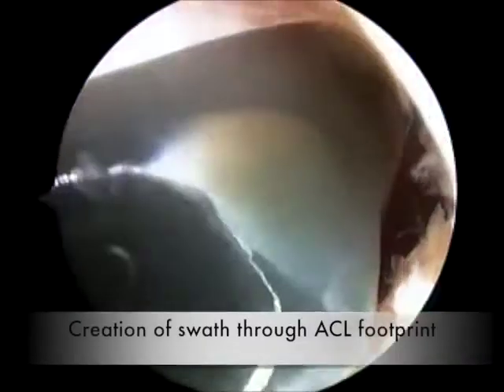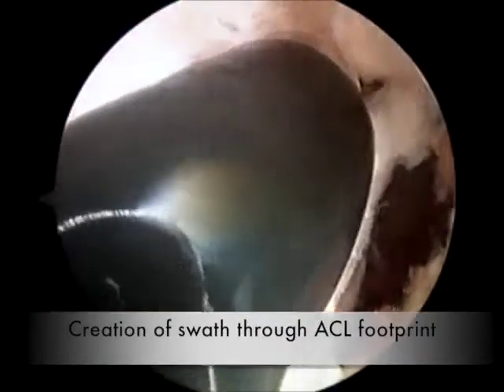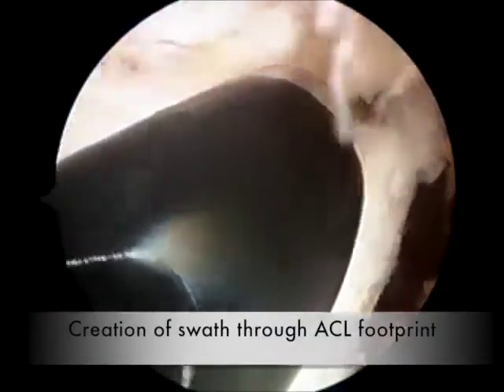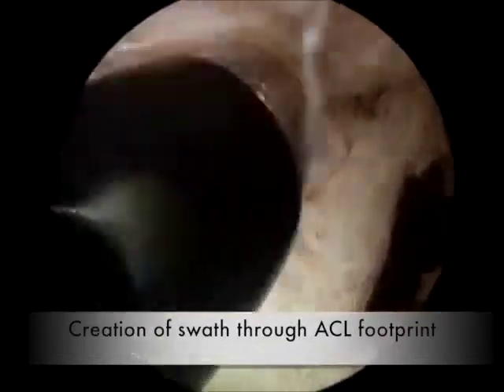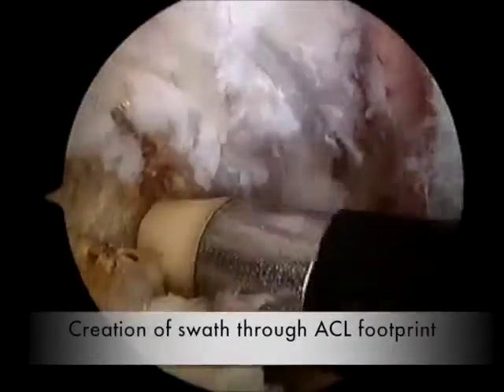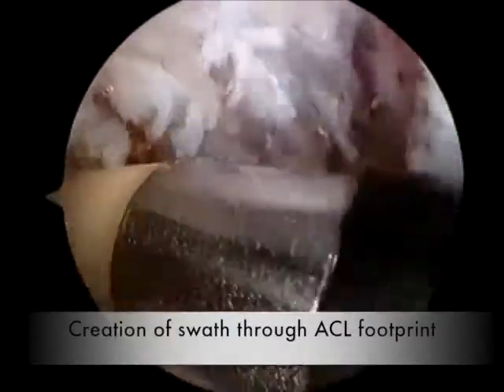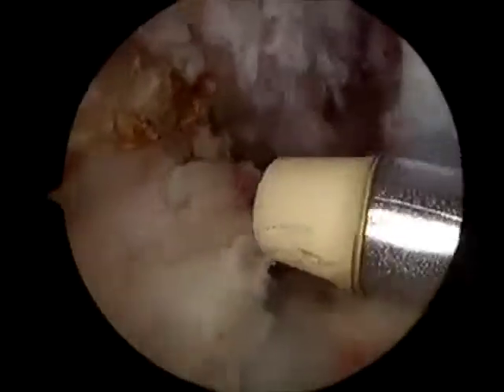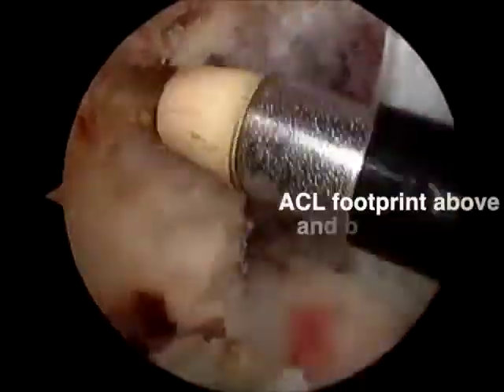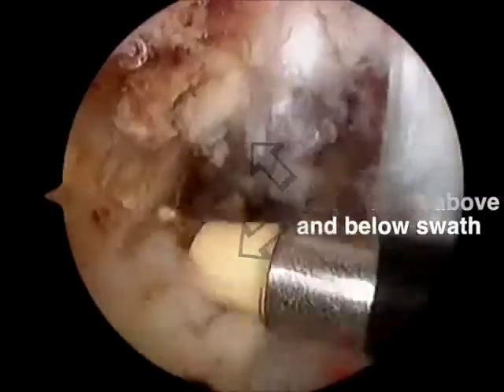Here we're using a radio frequency cutter, and starting from the back where the articular cartilage and synovial reflection met, we are going straight in line with the femur. That's straight distal in the anatomy. So here we have cauterized through the middle of the femur, and we can clearly see large amounts of ACL footprint above and below the cauterized region.